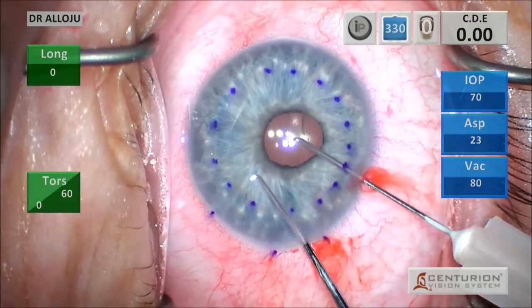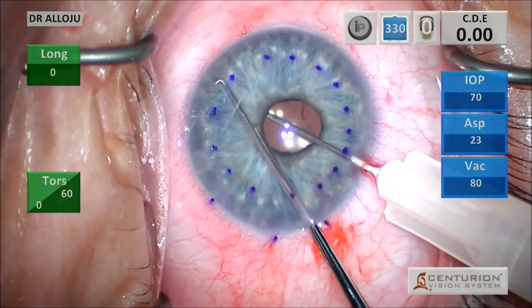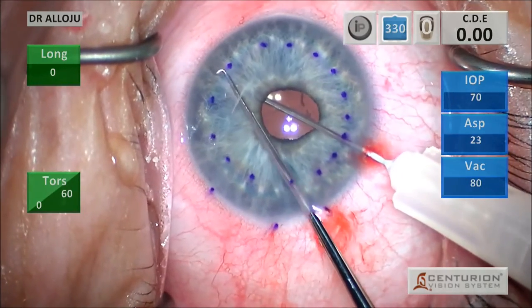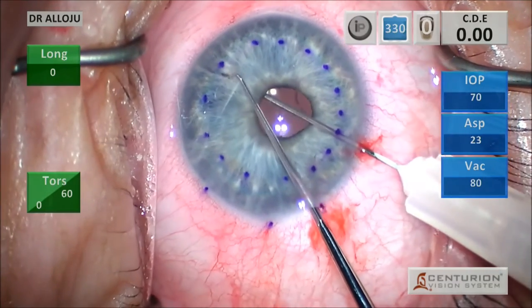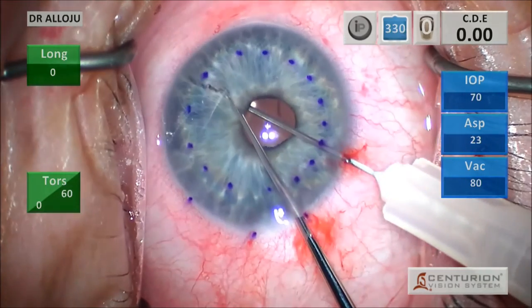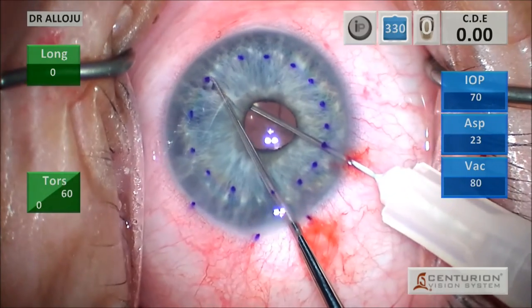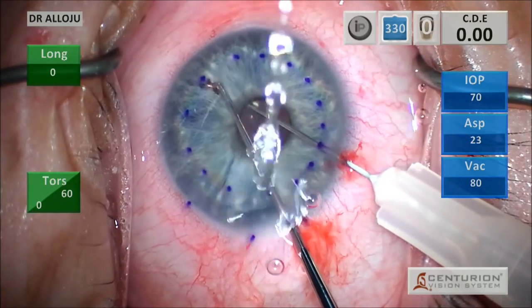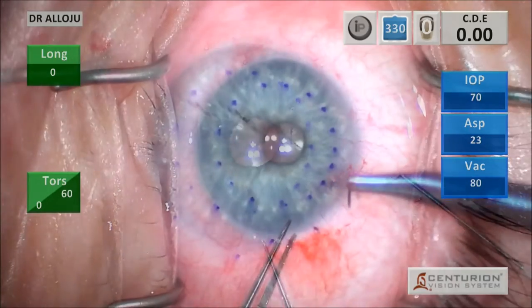So I've taken a 30-gauge needle, half-inch, and I've basically bent it. This maneuver is quite awkward, and part of it is blind, and you want to be really careful here because you can cause an iris hemorrhage. So you want to try to pick the area that's basically got the least amount of iris stroma, and you use the Sinskey hook to kind of scratch down over your bent 30-gauge needle until your needle is fully visible.